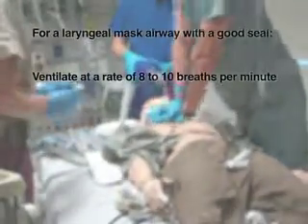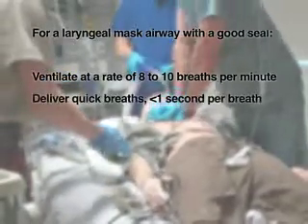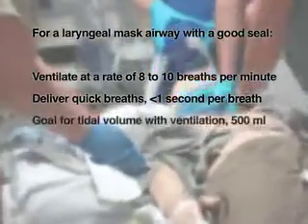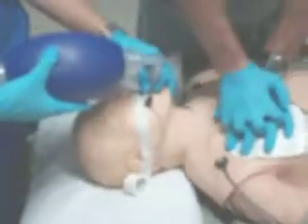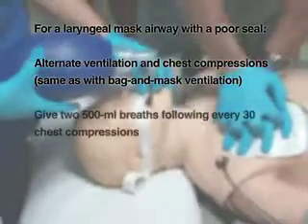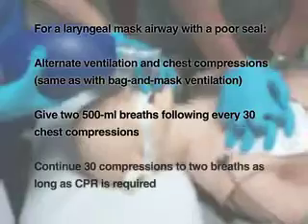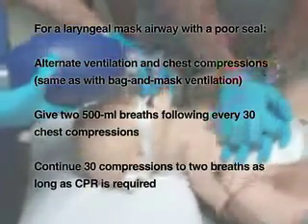Once the laryngeal mask airway is placed, the adult patient should receive 8 to 10 breaths per minute during continuous chest compressions. You should deliver quick breaths, ideally less than 1 second per breath, each with a volume of approximately 500 milliliters. If you hear air leakage during ventilation, you'll have to alternate ventilation and chest compressions. In the latter case, give 2 500 milliliter breaths following every 30 chest compressions. This ratio of 30 compressions to 2 breaths should be continued for as long as CPR is being performed.